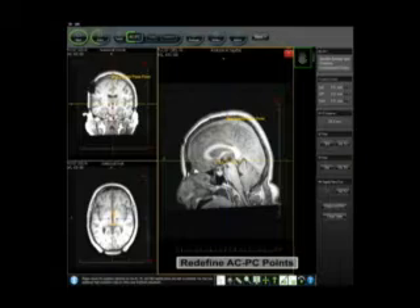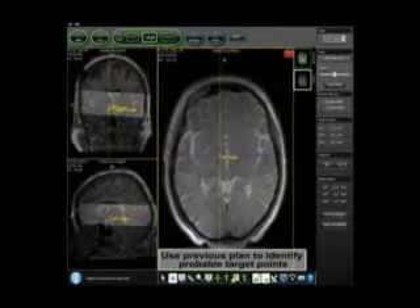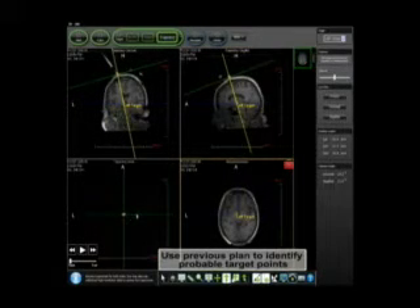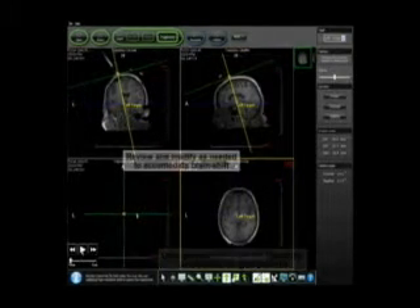With the smart frame attached, high-resolution images are then reacquired and presented to the physician to reconfirm the location of the neurological target and the optimal trajectory, and to take into account any potential brain shift that may have occurred.